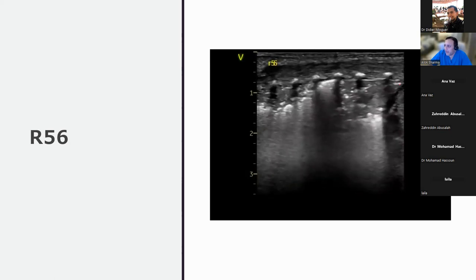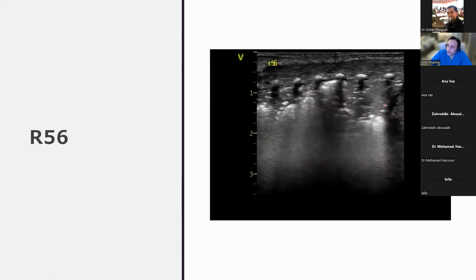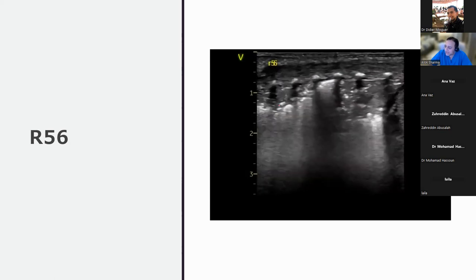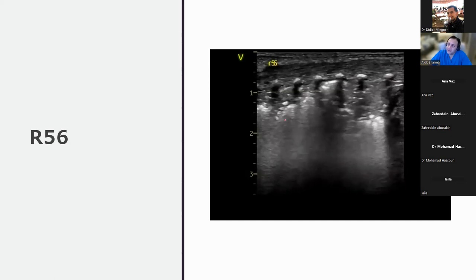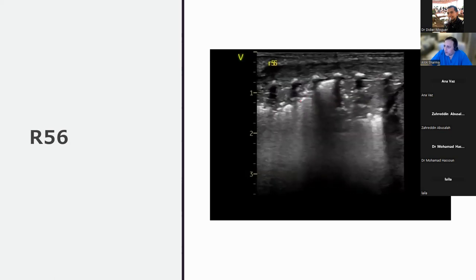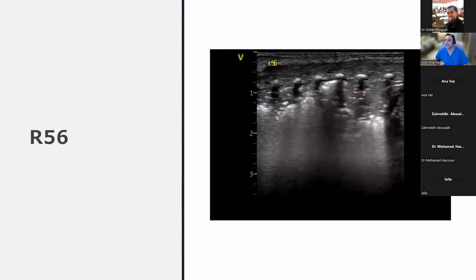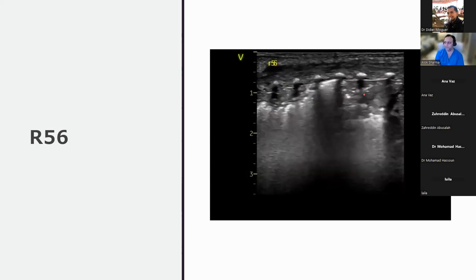And you basically have what looks like a compressive atelectasis here. It's very hypoechoic with, I would say, static bronchograms. I can't see any dynamic bronchograms. And that is the only point that goes against a pneumonia in this, is that if this was pneumonic, we'd see some dynamic bronchograms. For me, again, what you've got is, has the pleura fallen back here? And is this atelectasis or is this a pneumonia? And it's really confusing. So what you can do is put Doppler on it to try and help you. But is there anything else you can do?